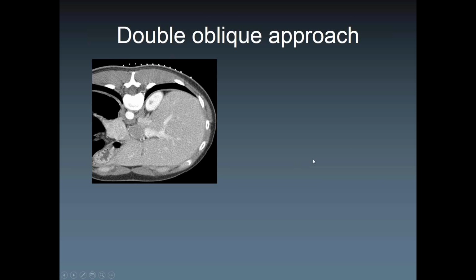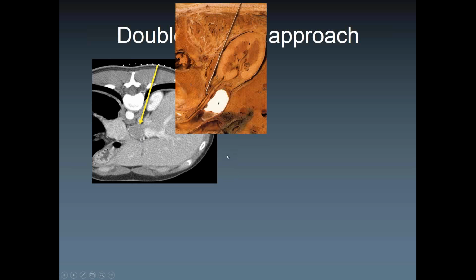So what if the target is not within a plannable plane? So let's say this one is a kidney here, right? And here's a target, right? It's just a subhepatic lesion. What you would have to do is you have to angle either the gantry or the approach or both, right? This is a CT-guided biopsy. You could also do an ultrasound-guided transhepatic biopsy, but in this case, the operator selected a CT-guided posterior approach, which is totally okay. You have to keep in mind, ideally try to not go through the kidney.